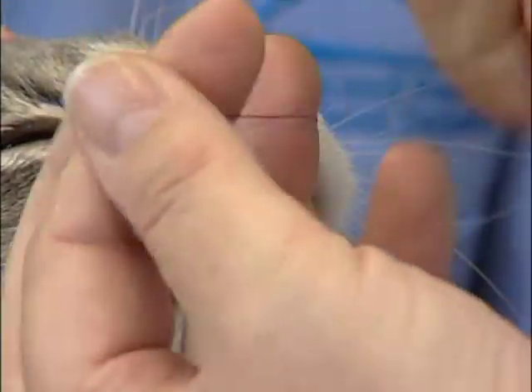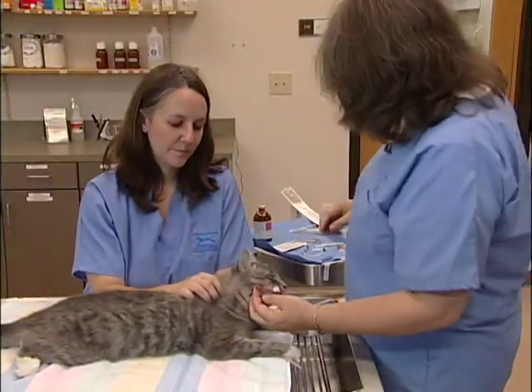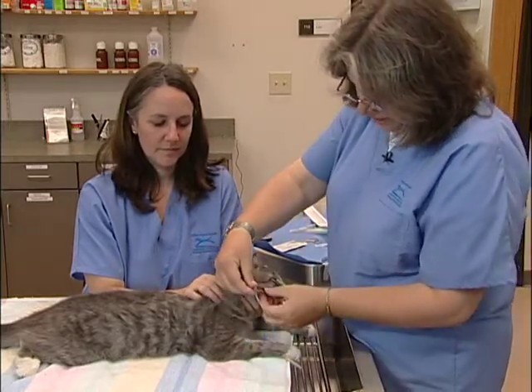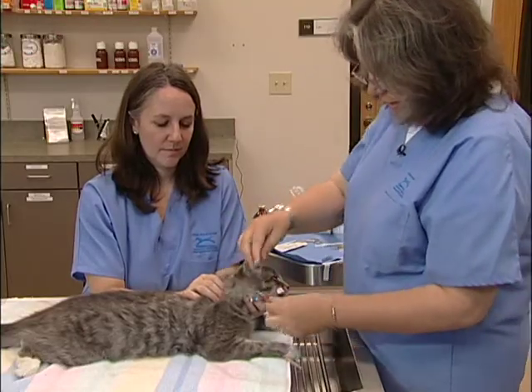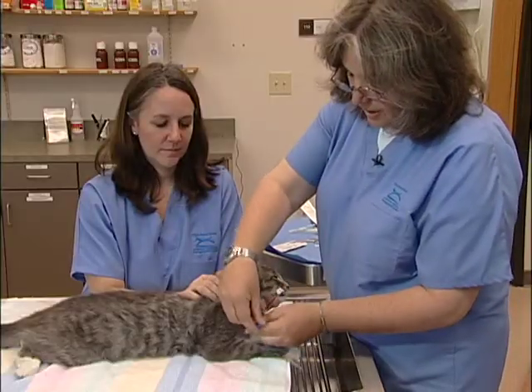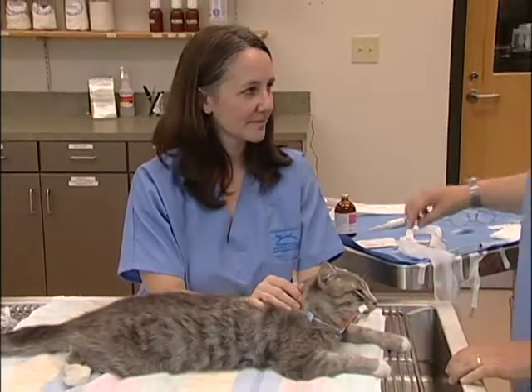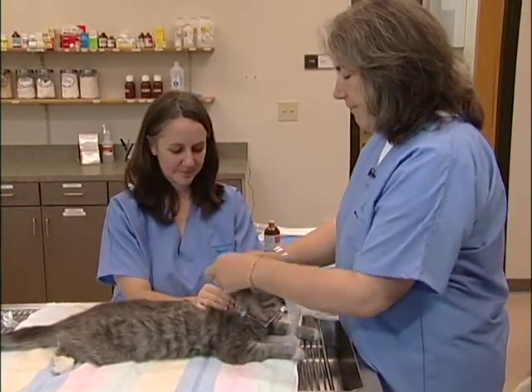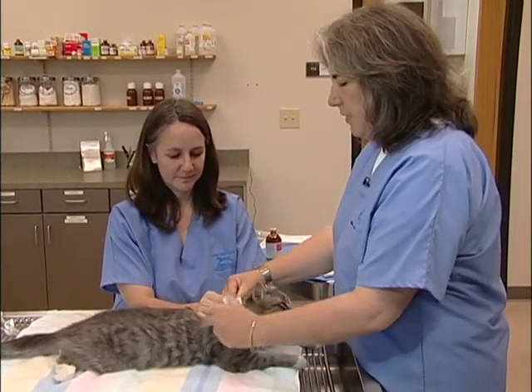I'm just going to put a simple interrupted suture here to hold it in place. Now I'm going to close the end of this using a T-port so that I have access for feeding later on. At the end of this T-port, I'll change this cap to an injection cap, and then I'll be able to feed directly through that cap. I'm going to take a simple piece of gauze and tie this in — we'll want this tube to stay in for a couple days, so we want to tie it in pretty securely.